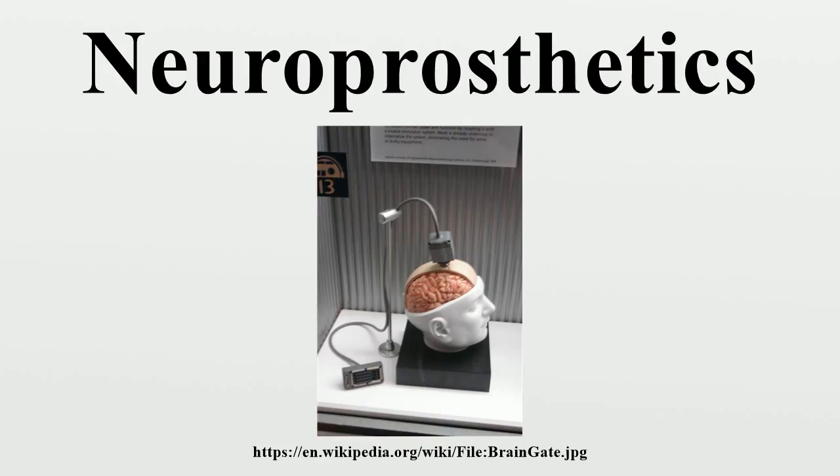Visual prosthetics. A visual prosthesis can create a sense of image by electrically stimulating neurons in the visual system. A camera would wirelessly transmit to an implant. The implant would map the image across an array of electrodes. The array of electrodes has to effectively stimulate 600-1000 locations. Stimulating these optic neurons in the retina thus will create an image. The stimulation can also be done anywhere along the optic signal's pathway. The optical nerve can be stimulated in order to create an image, or the visual cortex can be stimulated.